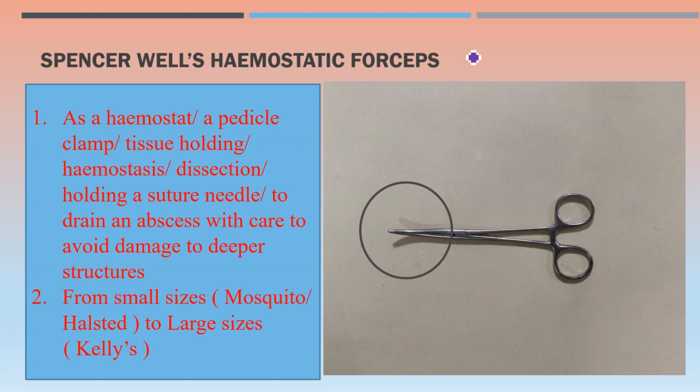The first one is Spencer Wells hemostatic forceps. Its uses as a hemostat include: holding a pedicle, tissue holding, hemostasis, dissection, holding a suture needle if a needle holder is not available, and sometimes to drain an abscess with care to avoid damage to deeper structures — so when a sinus forceps is not available, this Spencer Wells hemostatic forceps can be used.